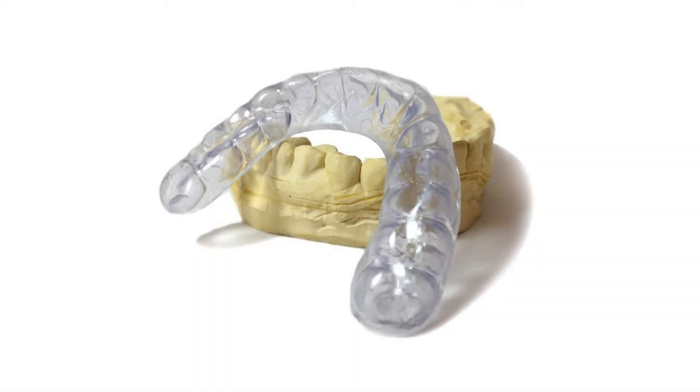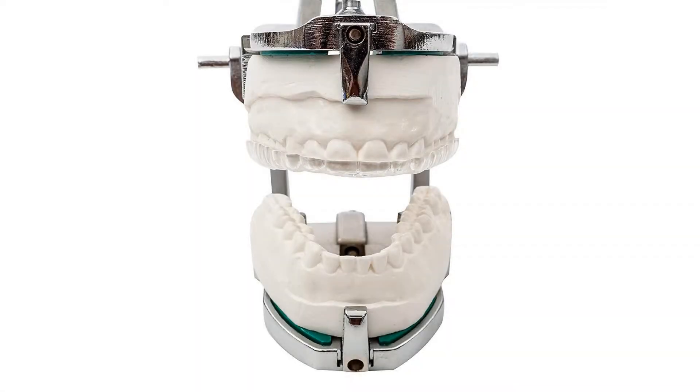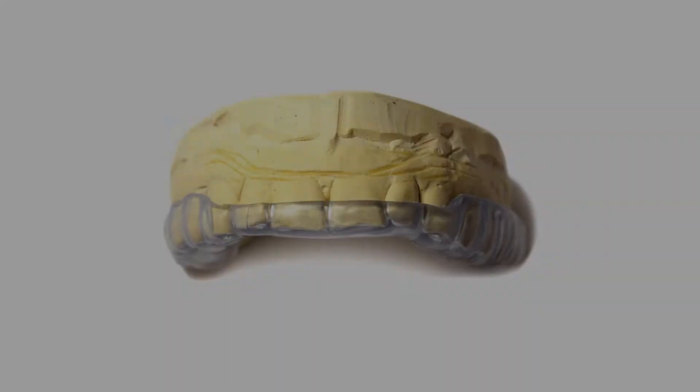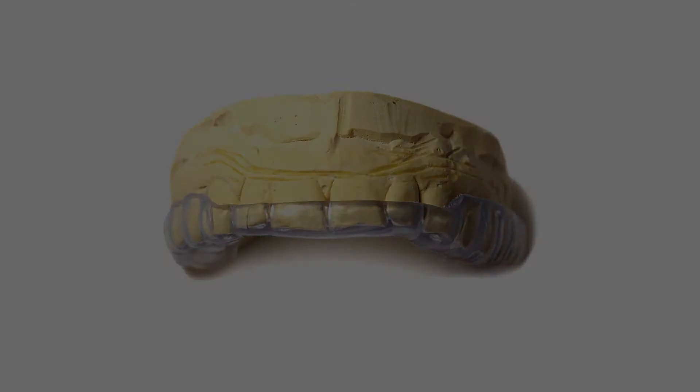Over-the-counter boil guards may seem cheaper, but it'll cost you more in the long run and you'll have to compromise the fit and comfort. You can also buy a high-quality custom-made night guard from your dentist, but you'll end up paying much more.